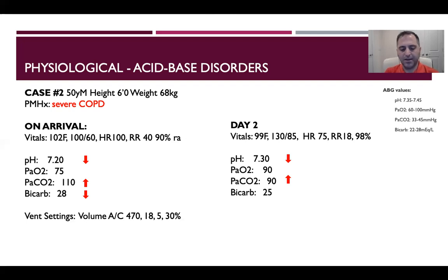Although I think Nancy had a slightly different twist for this case scenario, right? Yeah, Victoria, we'll talk about your concepts in like two slides. So good job. But basically the only thing I wanted to talk about with this was hammering in the same thing, where you're looking at the trends here, but the fact that he does have COPD.